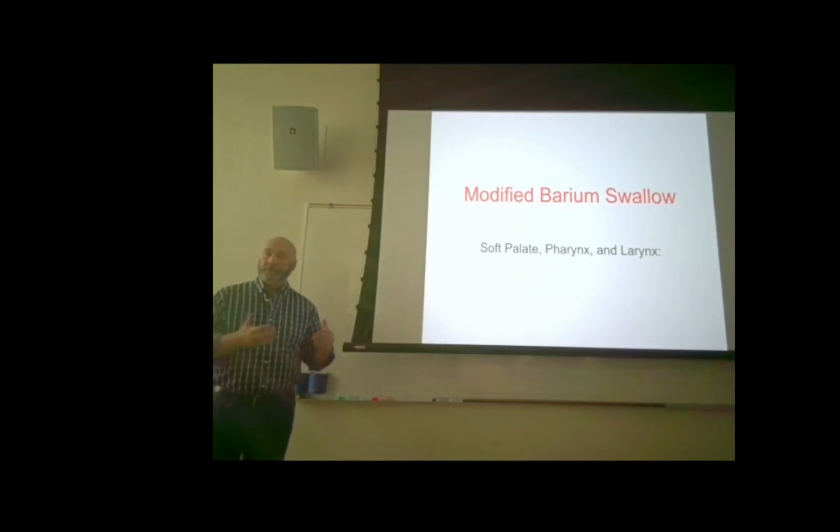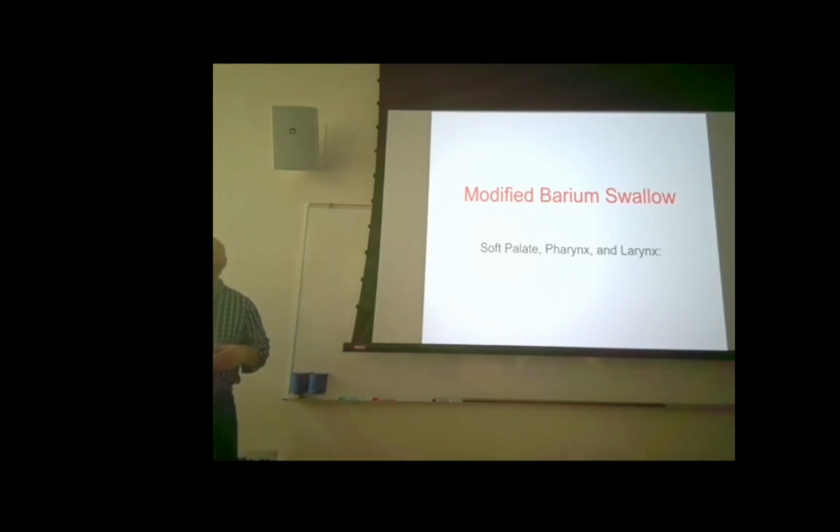So you're going to have at least all four of those: thin, thick, thicker, and then paste barium. You're also going to have something to put the barium onto, especially the paste barium, to get it to the patient. Something like a cracker or marshmallow, you're going to have that available as well.